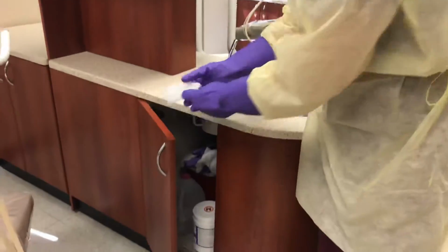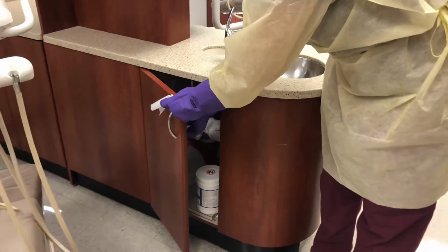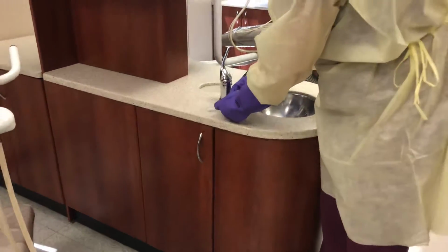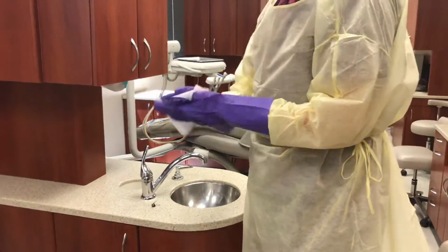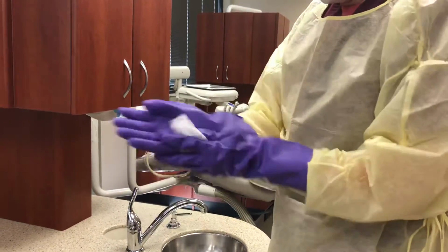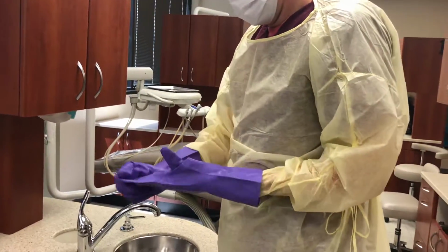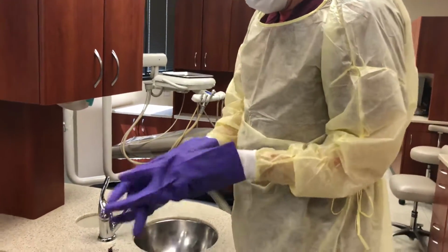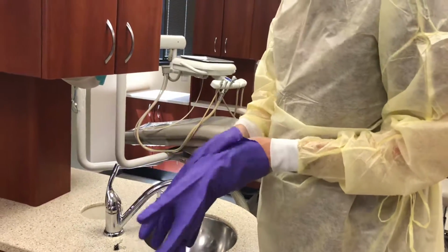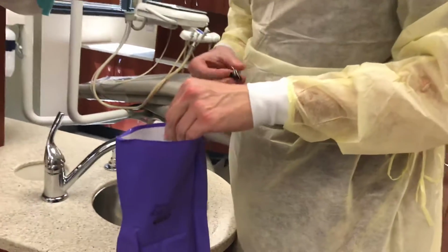It is very important that you snap that Virex lid completely closed, or the Virex towelettes will dry out and they must be thrown away. Notice how he is wiggling now out of these gloves so that he is not touching the outer surface.